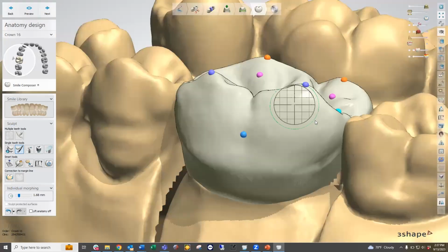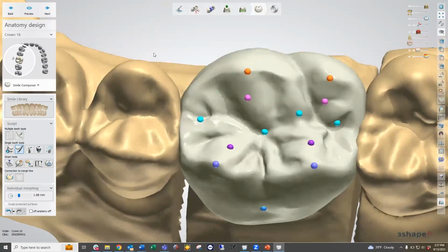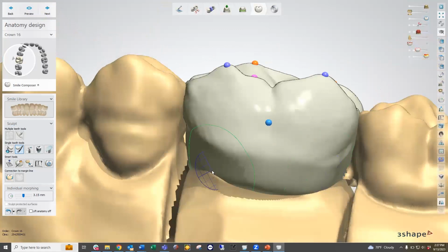Okay, so you can make adjustments there. We can go ahead and make our final changes. So at this point, I'm just looking at the overall shape of our crown and seeing what needs to be adjusted. Go ahead and thicken this up. I might bring this in because it's a little bit too much or impeding too much in this area. Just going to do some final changes. Maybe I bulk out this area down here a little bit more to make it a little bit smoother.